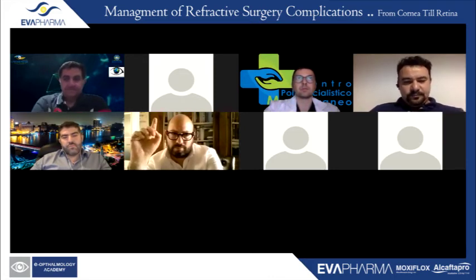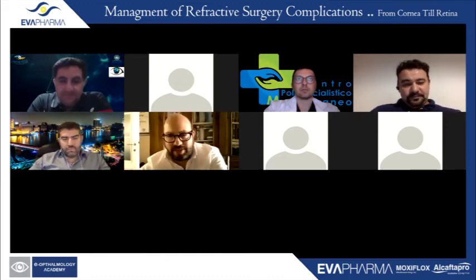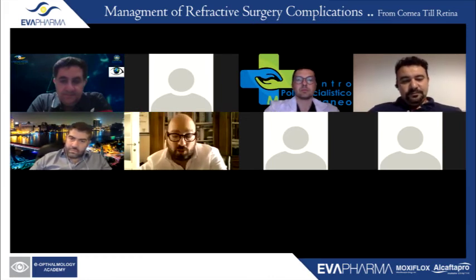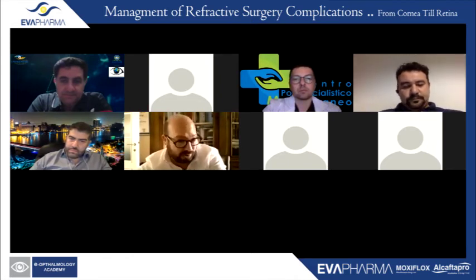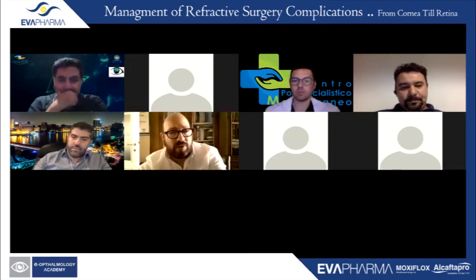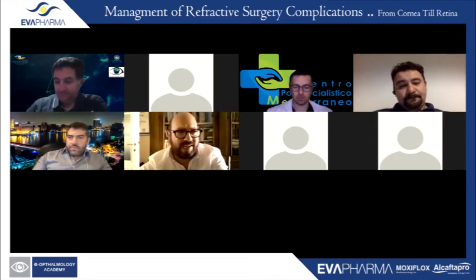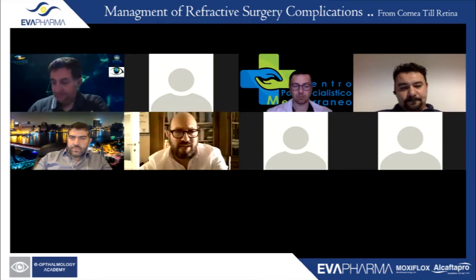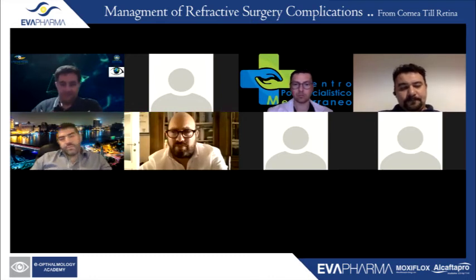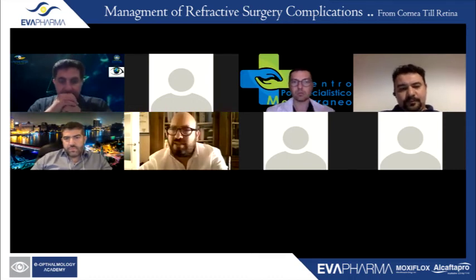Cosimo, yes, I have two considerations. I think that in these cases, confocal microscopy is useful in the pre-op and also for the diagnosis. Another test is the inflammatory test from RPS, which could measure matrix metalloproteinase-9 in the tear film and could be useful in these patients. What do you think, Tarek?